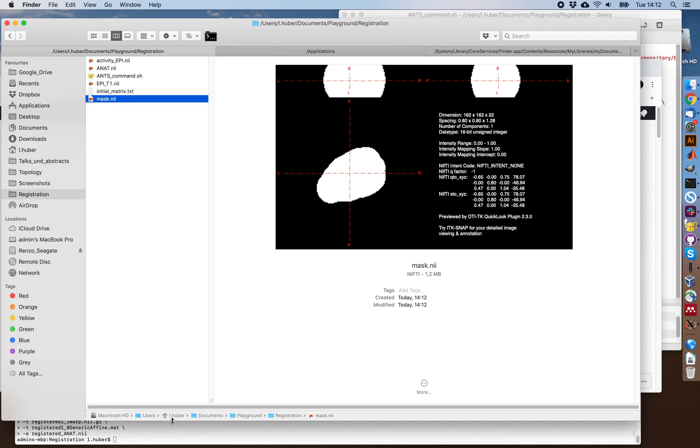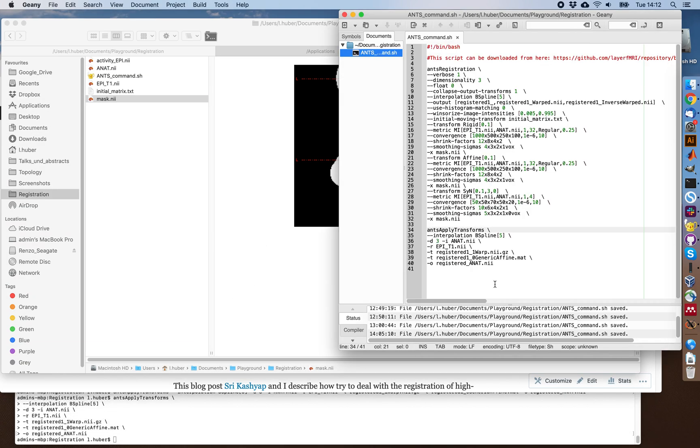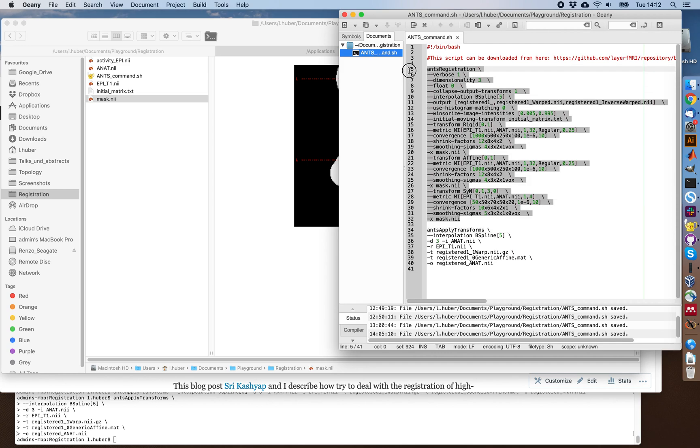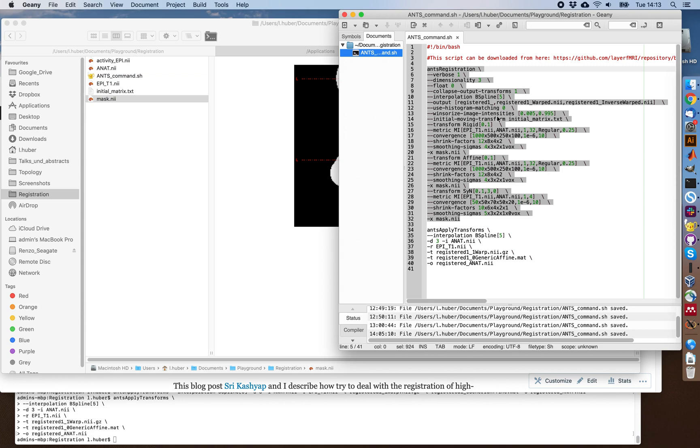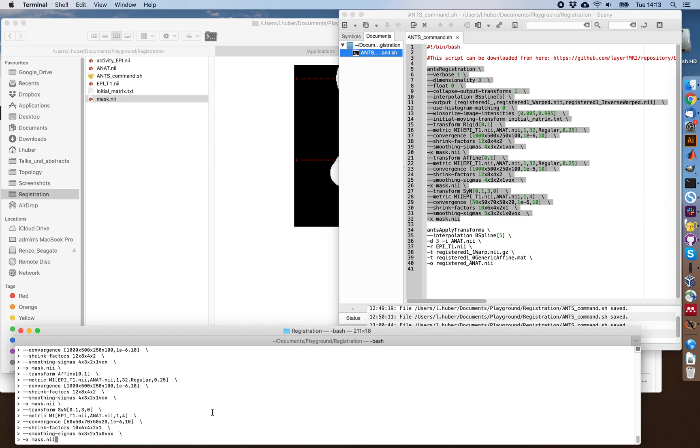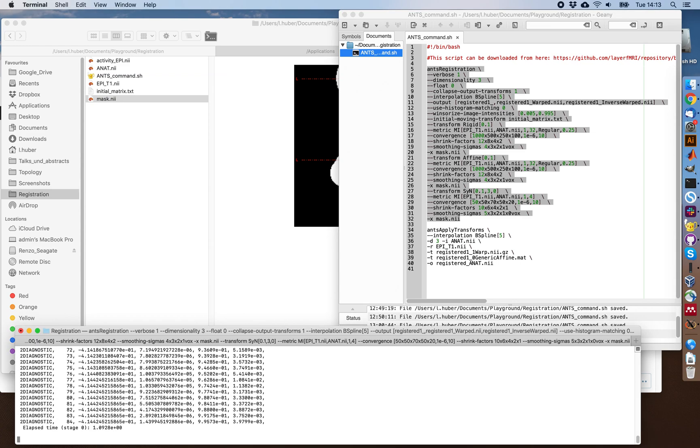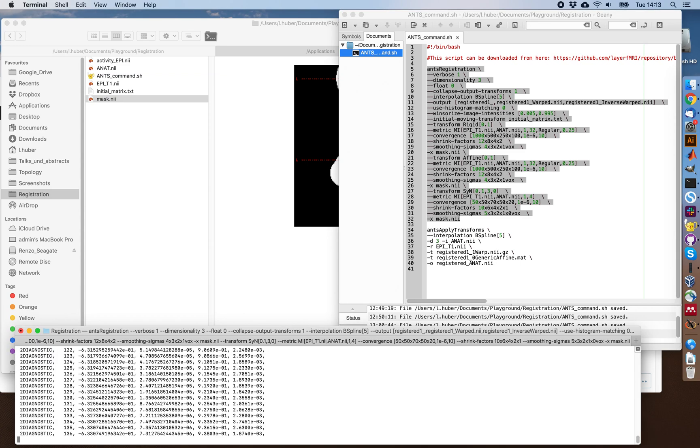And with that, we can then try to start ANTs with this command. So this command basically calls the ANTs registration. It tells the algorithm what to do, for example, to register the anatomical image to EPI and not the other way around, and also use this mask file by using a first initial guess of the initial matrix. So let's try to run this. And this should take a few seconds or so.